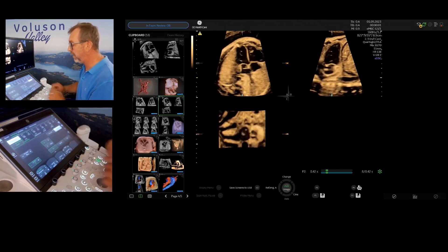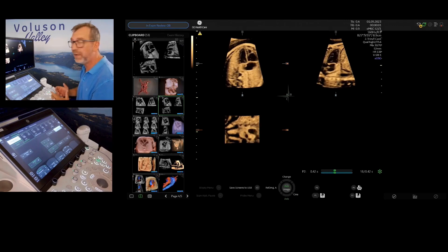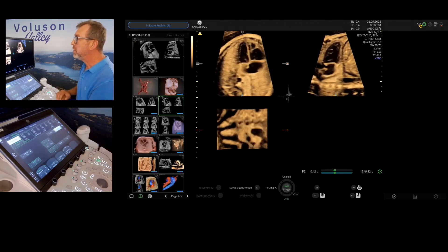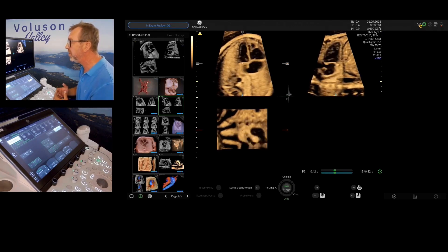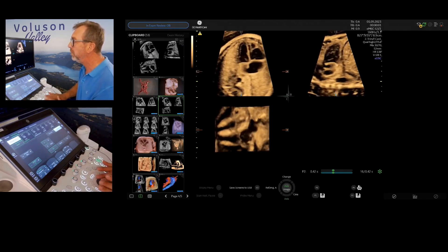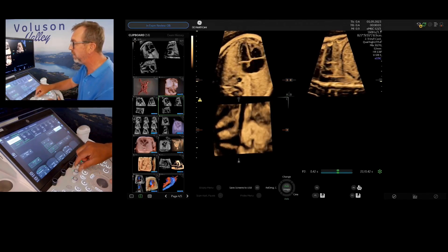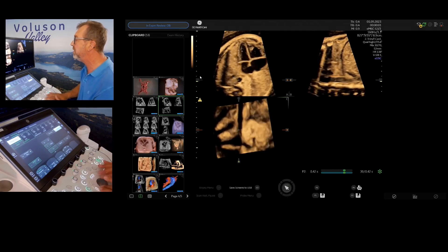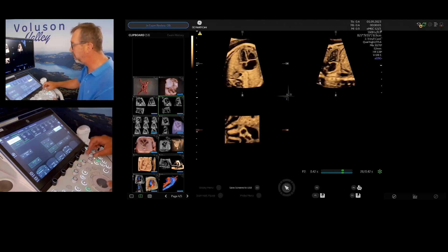When you rotate around the X, Y, Z axis and get lost, simply press the INIT button which brings you back to the start point after acquisition. To show the aortic arch, which is quite easy: in the A plane you can see the cross-section of the aorta - place your dot into the aorta. Make sure in the C plane everything is vertically oriented. In the B plane you can then see the aorta coming out - the so-called aortic arch. Then back to the INIT button.